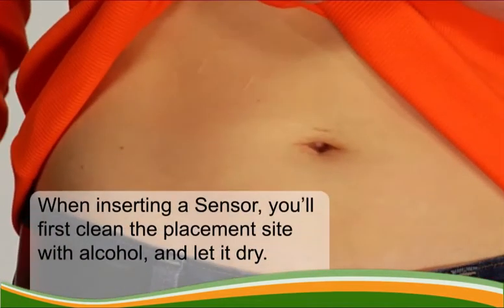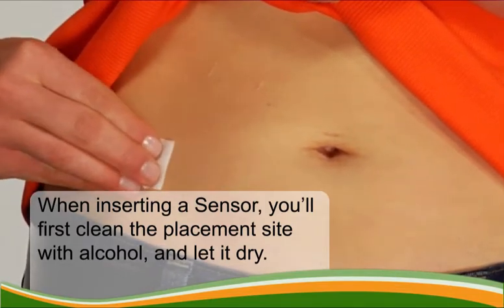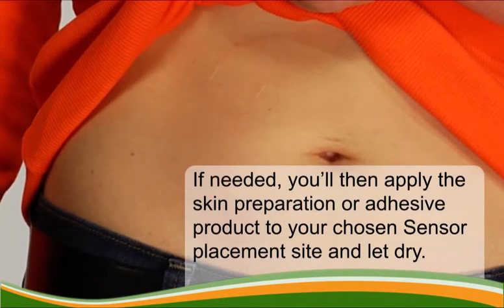Once you have chosen your site to place your sensor, you'll then clean the placement site on your body with alcohol and let it dry. To help the sensor stick to your body, you can also use skin preparation or adhesive products, for example, skin tack or mastisol. These products are optional and should be used prior to inserting your sensor on your body.